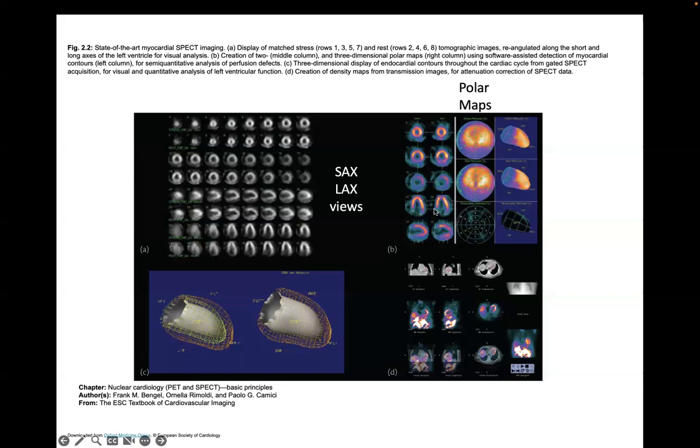You can see on this one, it looks like there might be some kind of low blood flow right at the apex of this heart here in the long axis view, etc. And so the quality of these pictures is mostly wrapped up in the ability to actually estimate the blood flow as opposed to a high resolution picture of the morphology of the heart. This is, as you can see, a very low resolution map of the blood flow.